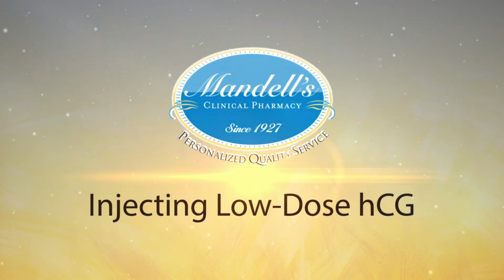Everyone. The following video is to show you how to properly prepare and administer a medication called low-dose hCG. You might first ask, why am I taking low-dose hCG? Low-dose hCG is a part of your cycle to help stimulate the ovaries to produce follicles. So it's a stimulation medication utilized to help stimulate those multiple follicles, whether you might be doing an intrauterine insemination cycle or an in vitro fertilization cycle.